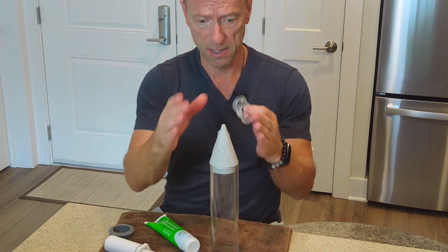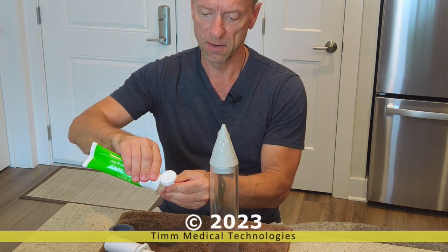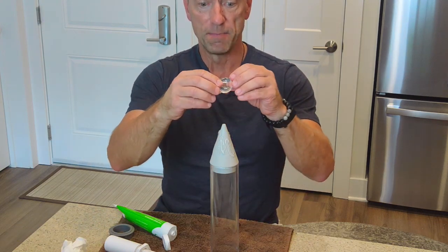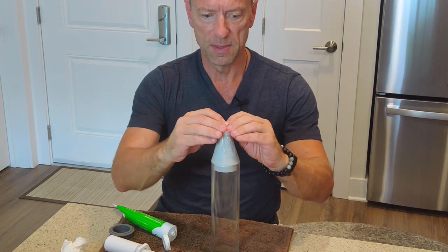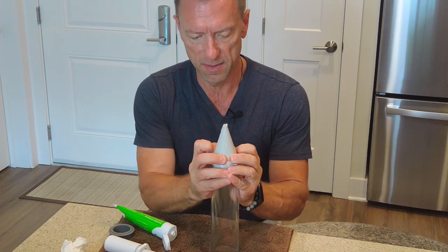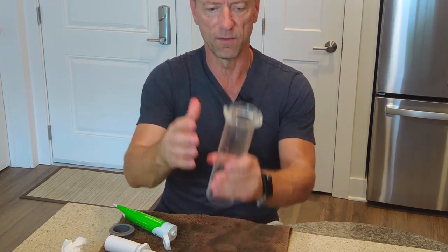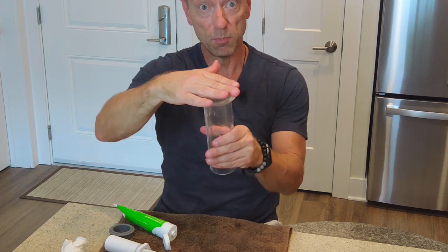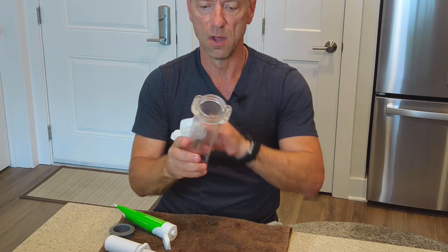I also want to lubricate not only the cone, but the inside of the tension ring. So I'm inside here. Once I'm here, this is up to you. This is a personal preference. I'm finding that for me, the easiest way to do this is to get my fingers on the outside of the tension ring and then just part of this, but I just want to get this here to the end, as close to the end of the cylinder, so that when I do build the erection, I'm able to just transfer that quickly from the cylinder onto the body.